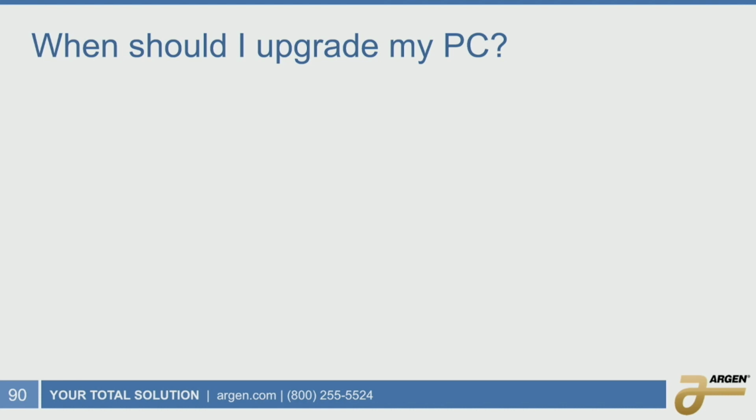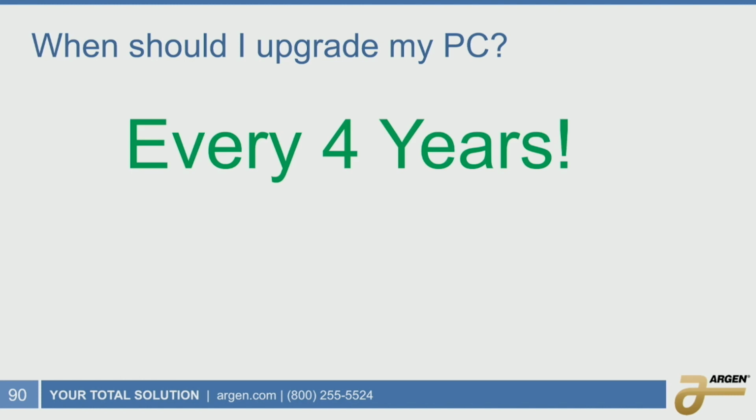Another big topic is PCs. PCs have a lot more to do with your CAM setup than you probably think. If you've got a system that's maybe a DBX50 from 2012, your PC is right now 8 years old. You are two times older than you really should be. The way hardware is changing nowadays, you should be swapping out your PC at the latest every 4 years if you want to make sure that you're getting the best out of your software. Every year the software is changing, based on the demands of the PCs that are coming out.